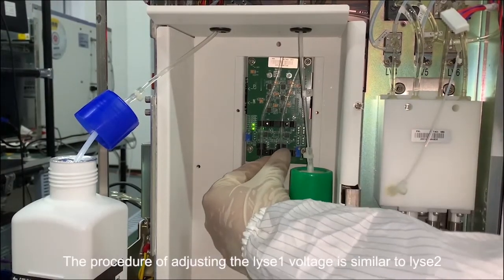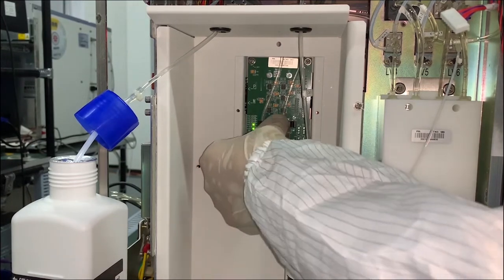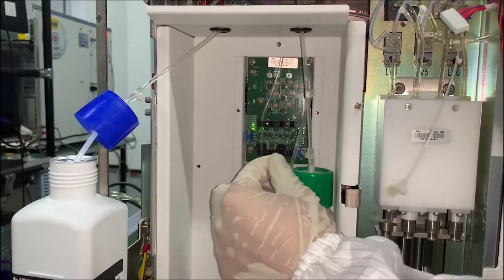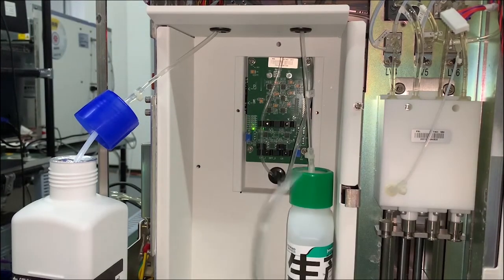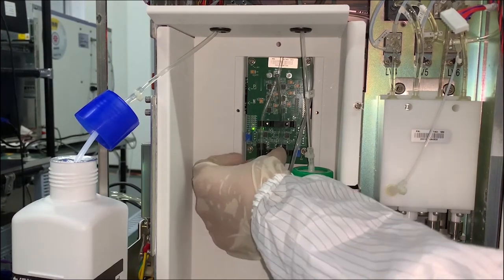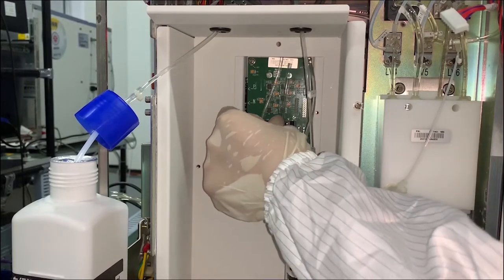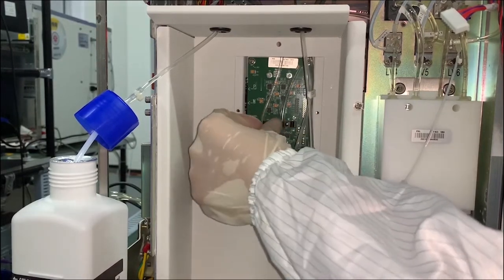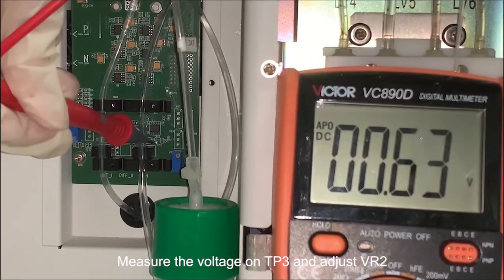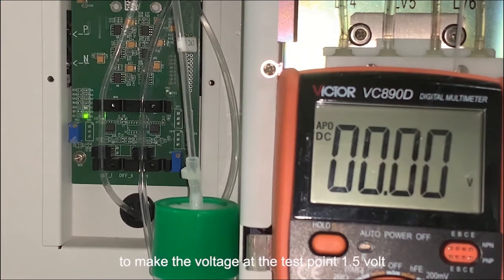The procedure for adjusting the line 1 voltage is similar to line 2. Measure the voltage on TP3 and adjust VR2 to make the voltage at the test point 1.5 volts.